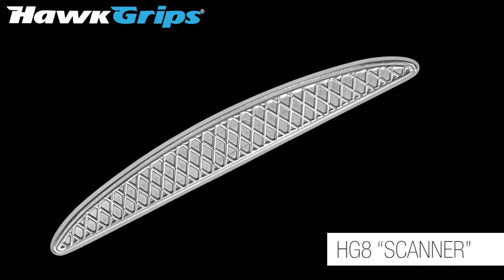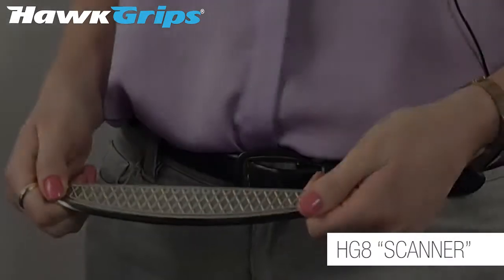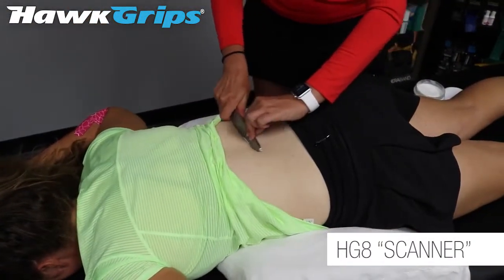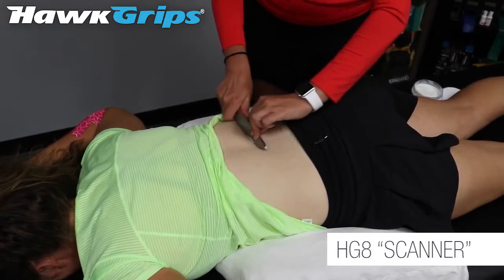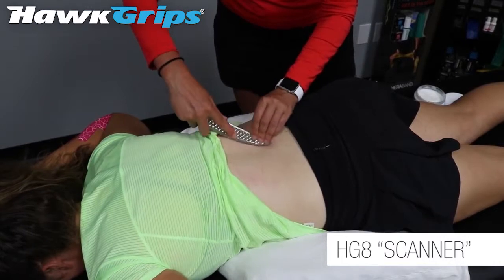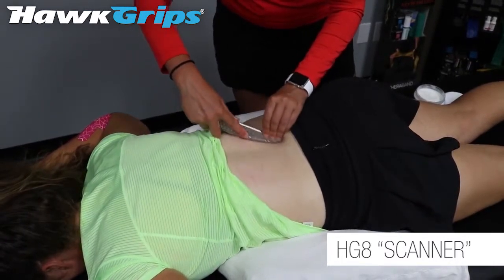This instrument has a beautiful broad convex surface and is used to scan for adhesions throughout the entire body. It's very comfortable — in fact most patients prefer this instrument. It's the only one of its kind having a large convex surface.